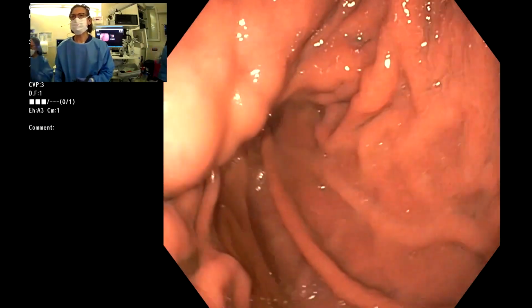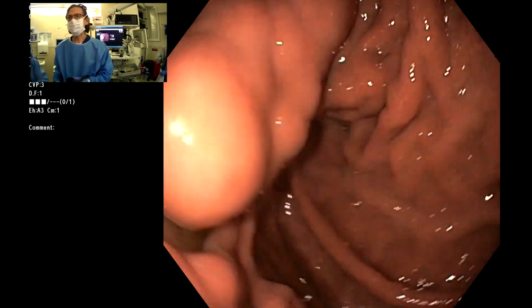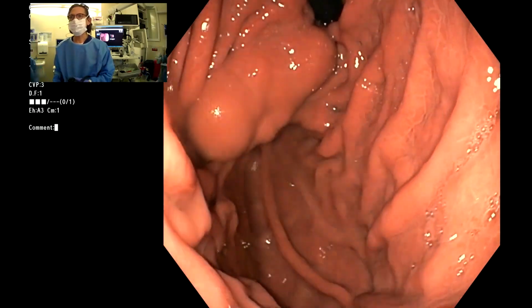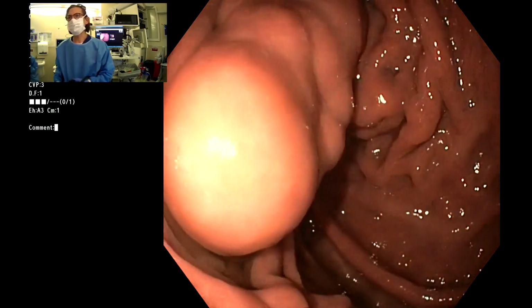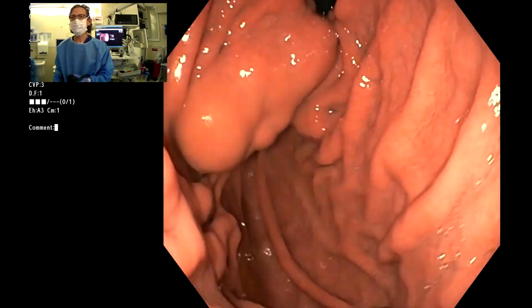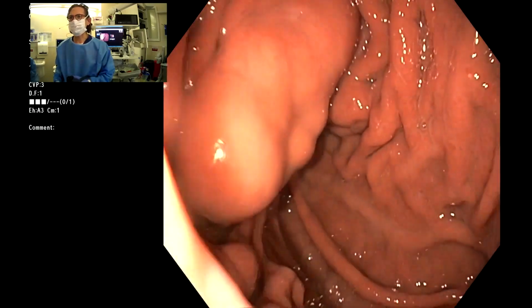43-year-old female with alcoholic liver cirrhosis. She is Child's A, MELD score of 10. She has had 2 variceal bleeds so far. Both were thought to be from esophageal varices and underwent banding. She's now doing fine. Our stomach is clear of any residual blood or anything, as you can see.